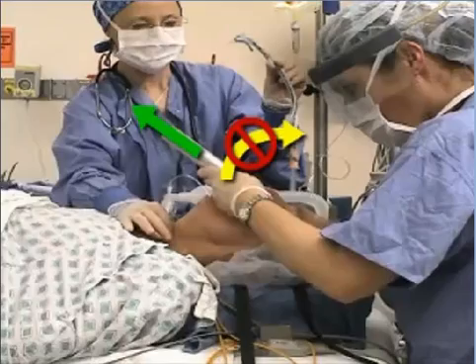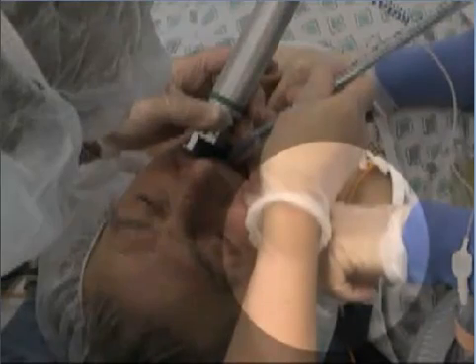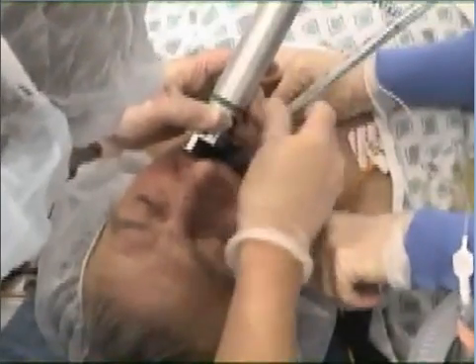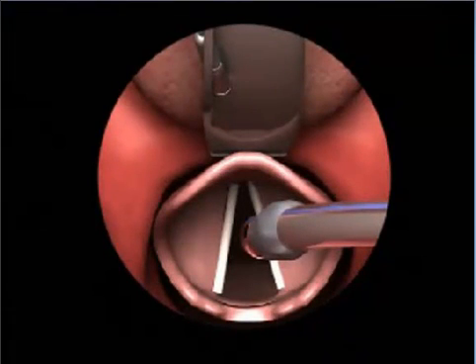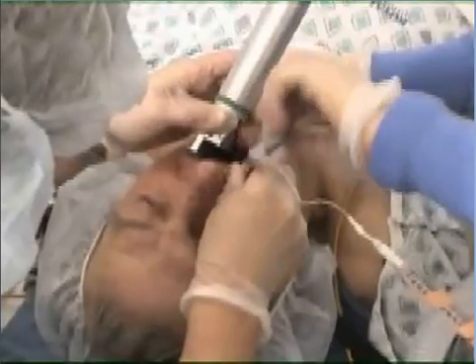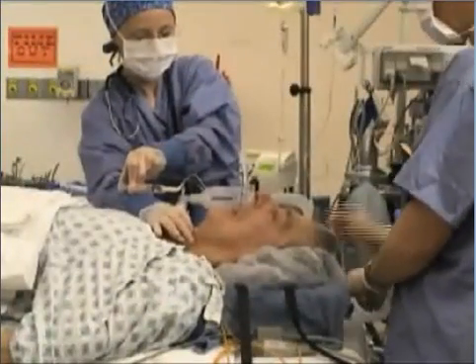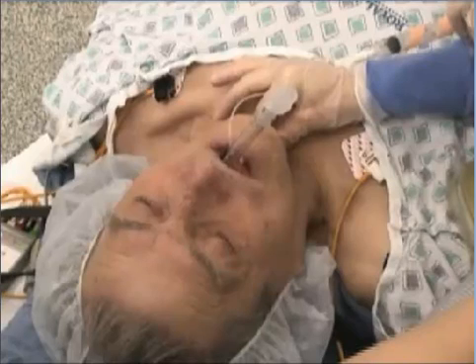If available, an assistant should gently pull on the right side of the cheek to enhance visibility of the glottis. Hold the endotracheal tube in your right hand. While maintaining your view of the vocal cords, insert the endotracheal tube into the right side of the patient's mouth. The tube should not obstruct your view of the vocal cords during this critical part of the procedure. Pass the tube through the vocal cords until the balloon disappears into the trachea. Remove the stylet and advance the tube until the balloon is 3 to 4 centimeters beyond the vocal cords. Inflate the endotracheal balloon with air to the minimum pressure required to prevent air leaks during tidal volume ventilation; this usually requires less than 10 cc's of air.